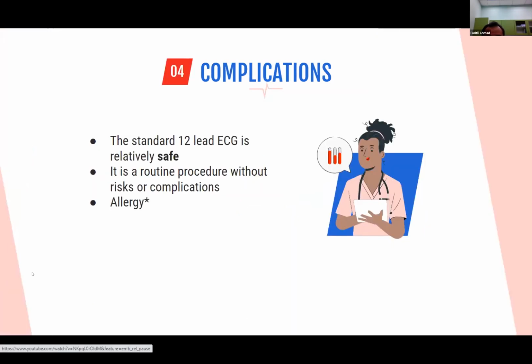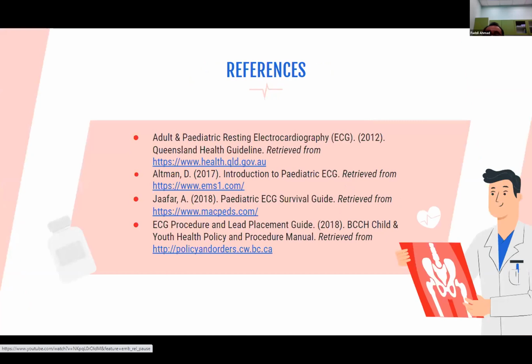So next, complications, the last part. Like I said before, the standard 12-lead ECG is relatively safe. It is a routine procedure without any risk or complications, but the possibility of allergic reaction can be prevented if you take a good history before you start the test. So these are my references. That's all from me. Thank you.